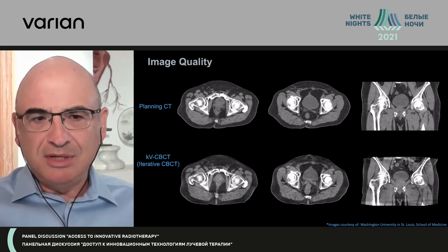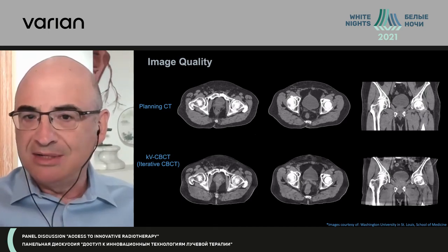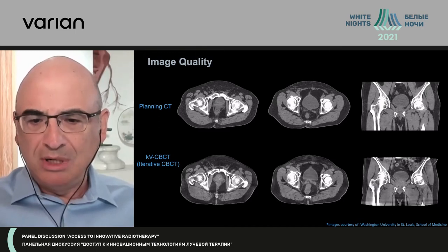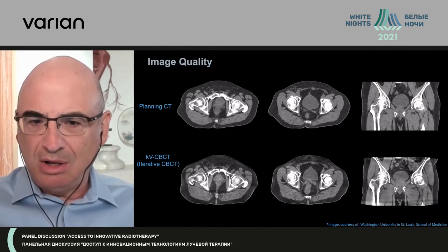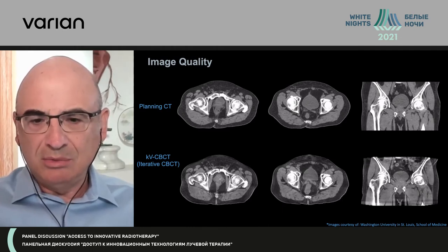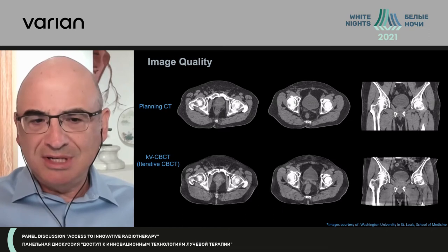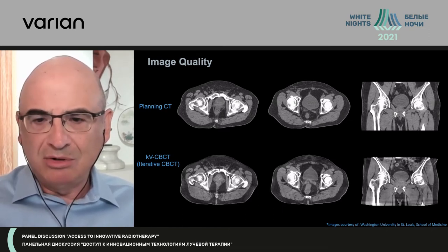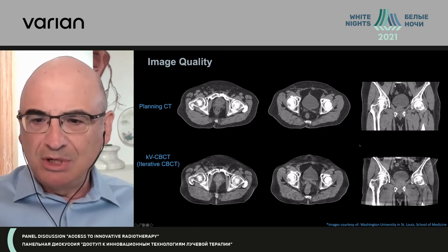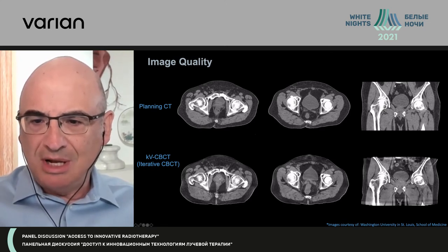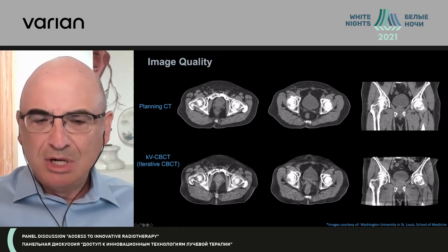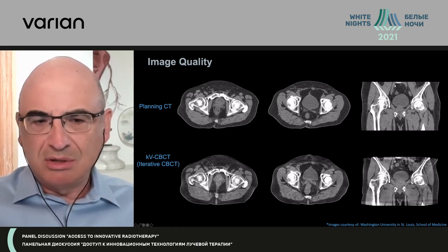The top row is in the pelvis, obviously a prostate case with a helical planning CT — this is the highest quality CT you can get. The bottom one is an image acquired on a Halcyon unit, similar to Ethos. You can see that it's practically the same, with some minor differences. If you look at the right lower side, you can see the details around the bladder. The quality of imaging is critical.